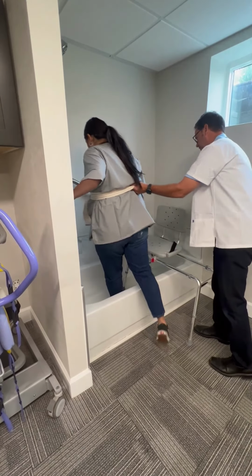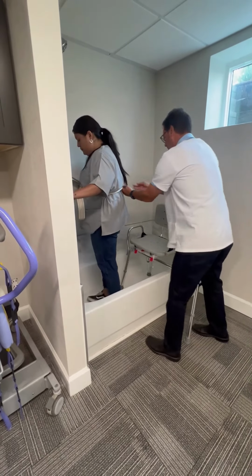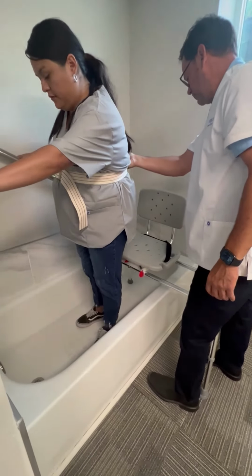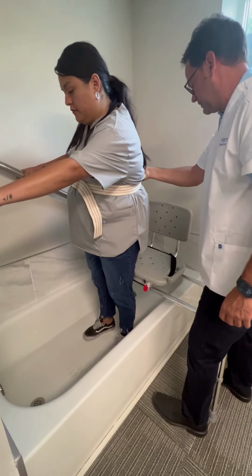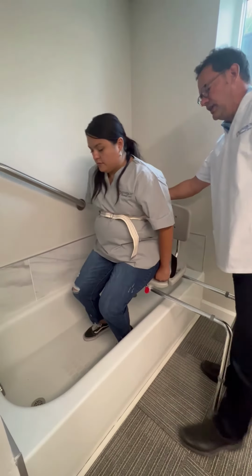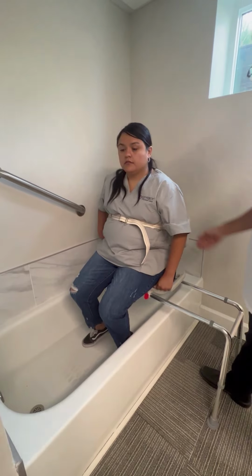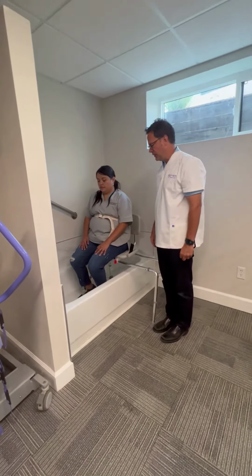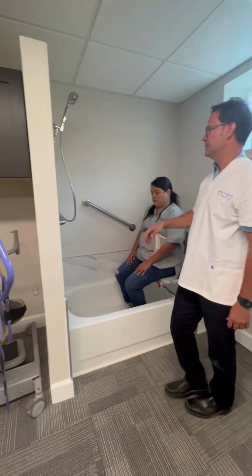And good, step in, grab that other bar, and then take a step back until you feel the chair on your leg, reach back and sit down. So we are in position safely in the shower. Now the next step, we have a plan.